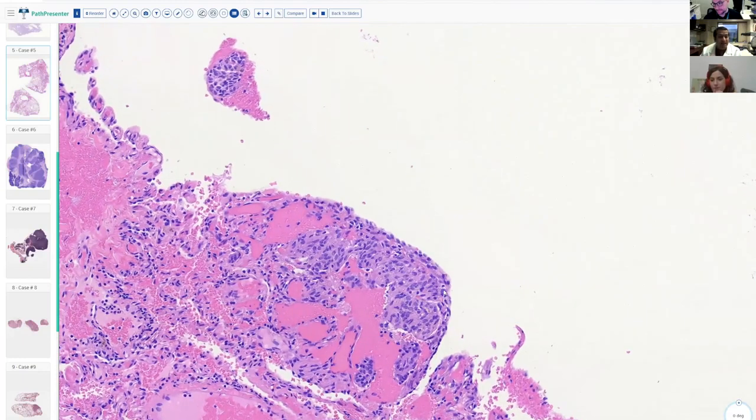The one I use is cathepsin K. It's a very strong marker. The problem with cathepsin K is that it's relatively new for this, so you don't really know what else could stain for it, but it's claimed, and at least in my experience it's true, that it doesn't mark other things, and it marks these PEComatous lesions. So that's another thing you could do in those negative cases.